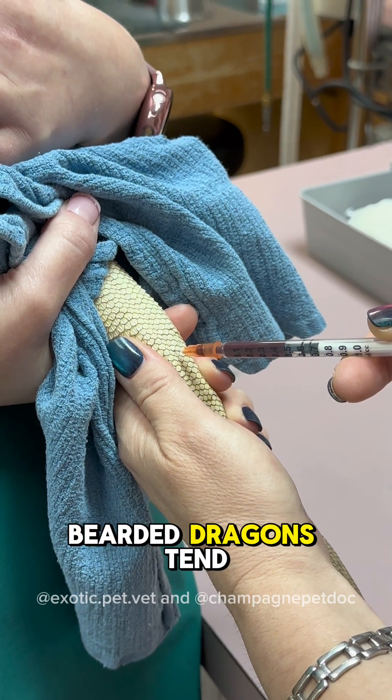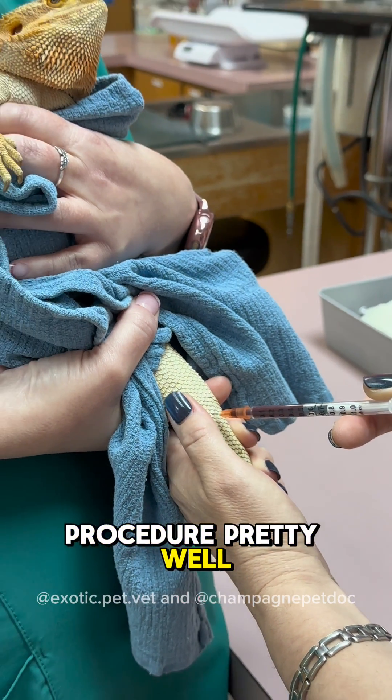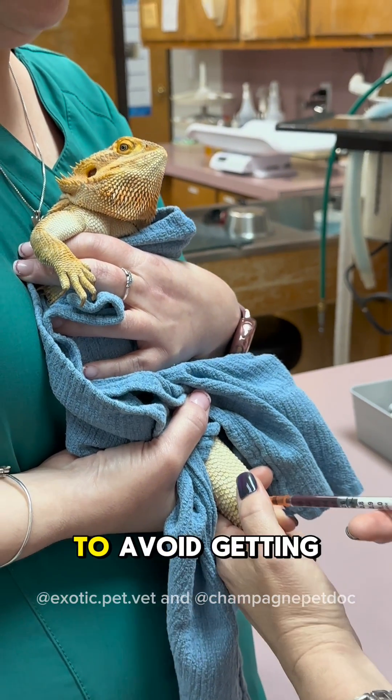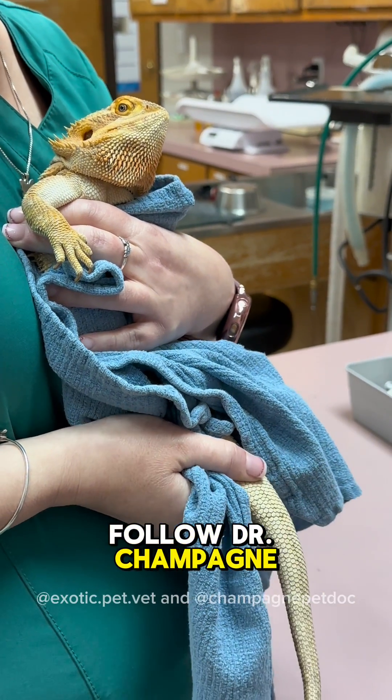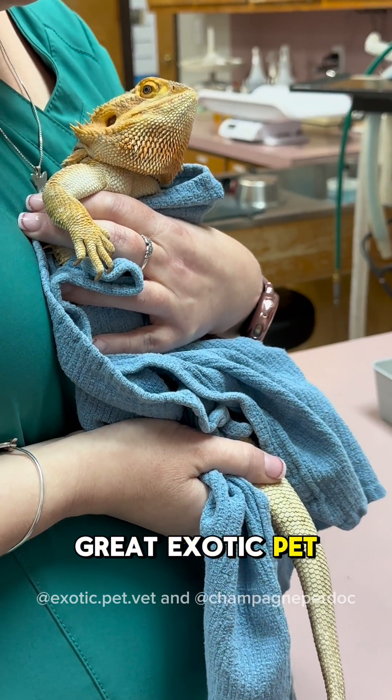As you can tell, bearded dragons tend to tolerate this procedure pretty well, though it may be useful to use a soft towel to avoid getting spiked by their scales. If you like this video, be sure to follow Dr. Champagne for more videos, as she creates great exotic pet content as well.